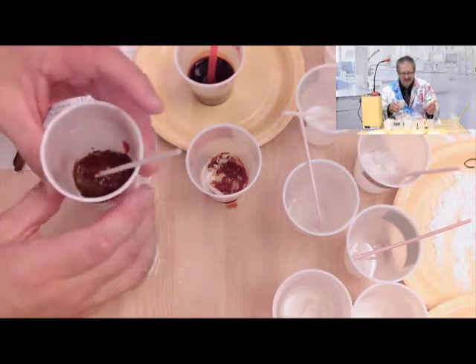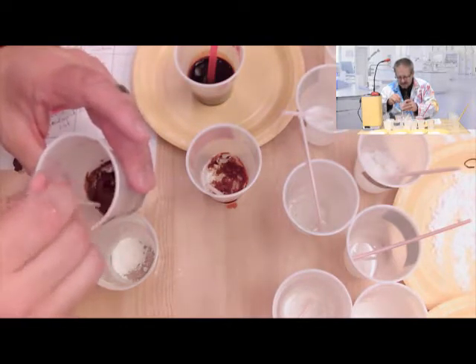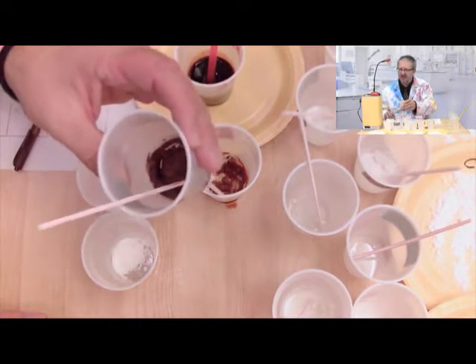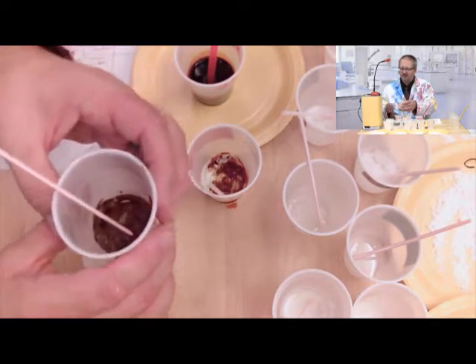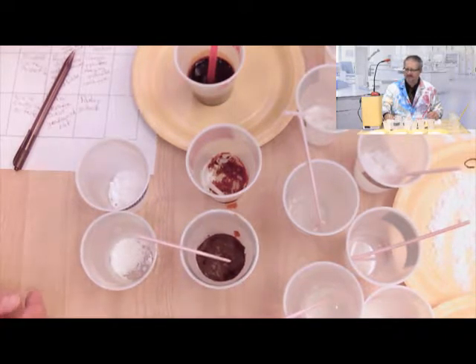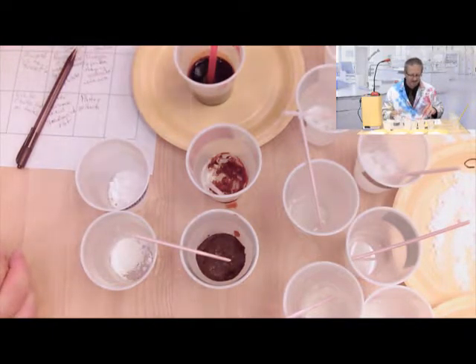By the way, the iodine I'm using is basically povidone iodine that you can get in any drugstore, like a pharmacy. It's povidone iodine. It's 10% iodine, so it's pretty easy to get. It doesn't have to be pure iodine or anything like that. That'd be crazy. You wouldn't want to use that.